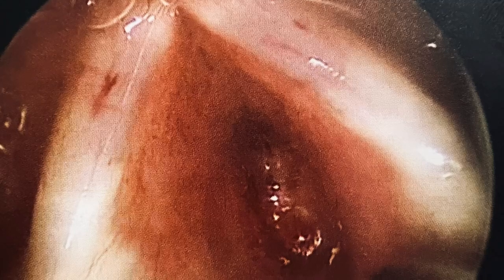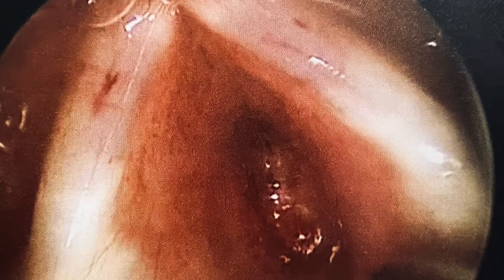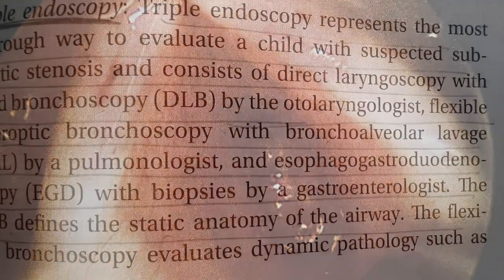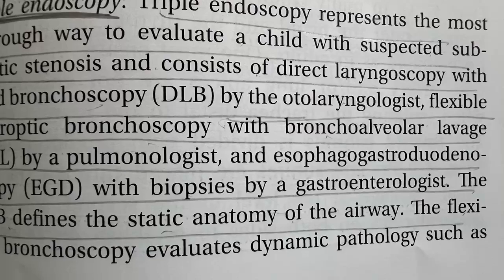Advantages are complete airway and digestive tract evaluation in one session, avoiding multiple anesthetics, and it detects multi-level pathologies, both airway and reflux disease, and it also facilitates multidisciplinary management. Risks of this are airway trauma or edema, hypoxia during procedure, aspiration or bleeding may be there.